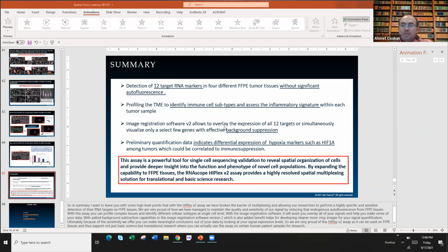And in the meantime, as we wait, is there any amplification variability that you observe? Like there's a distribution. Those Z probes, there's some stochasticity of binding, still. You mean for the probes for different target transcripts? We have our probe design team, where we go through what we call feasibility of probe design.